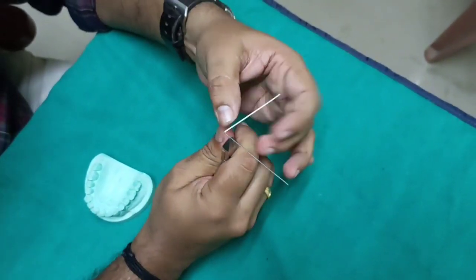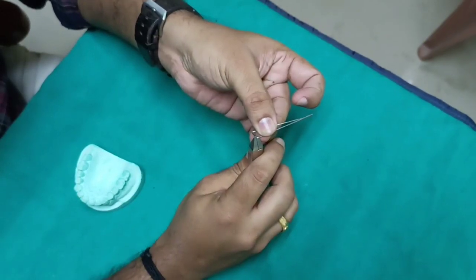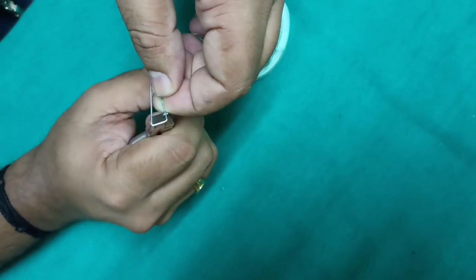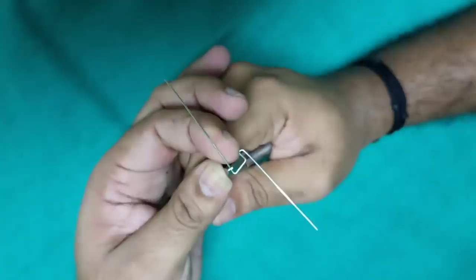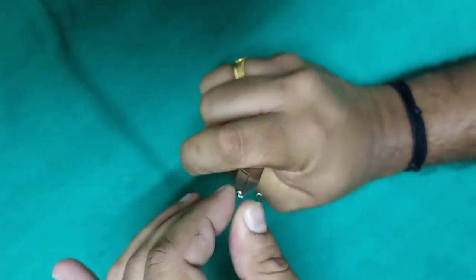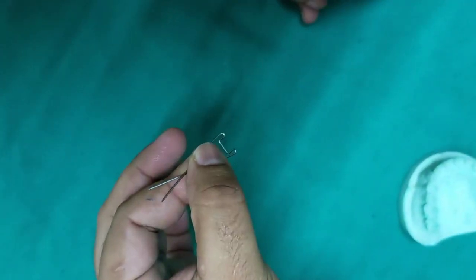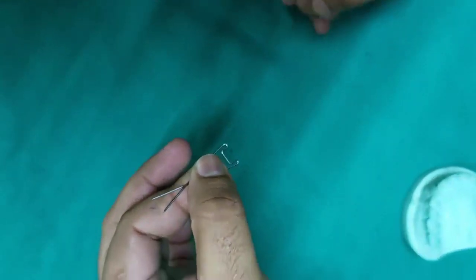The first bend is a little more than a right angle. Two such bends are made which are connected by a bridge. The second bend is made in two stages of 90° each. The wire is first bent at right angles. The next 90° bend is given by bending outside the plier's beak. This way a 180° U-turn bend is given and this forms the arrowheads. Then you contour the arrowheads with plier beaks and adjust the slope of arrowheads to follow the gingival margin.